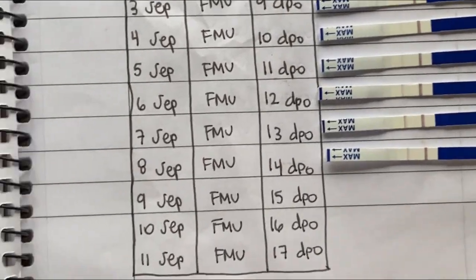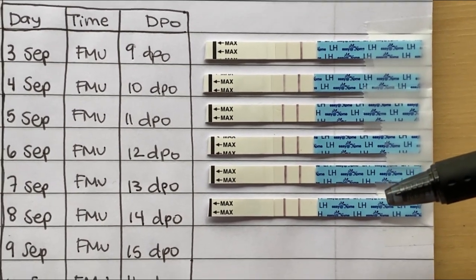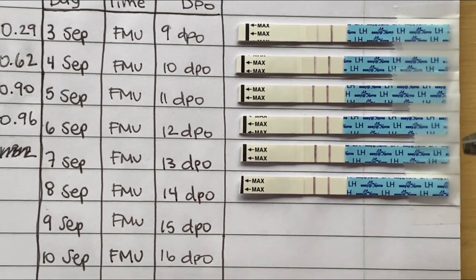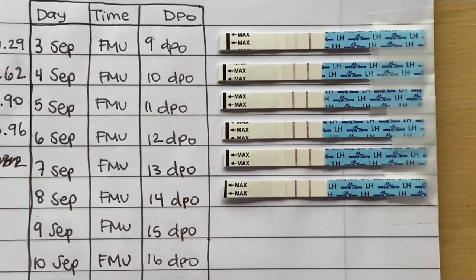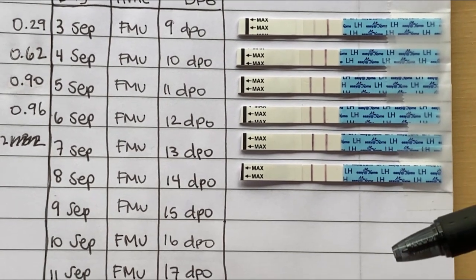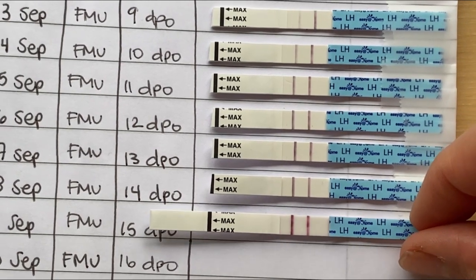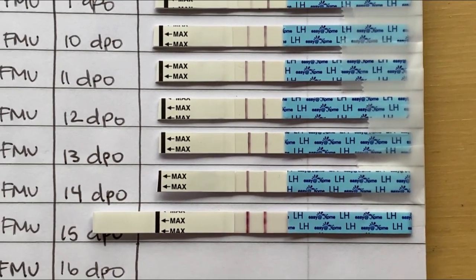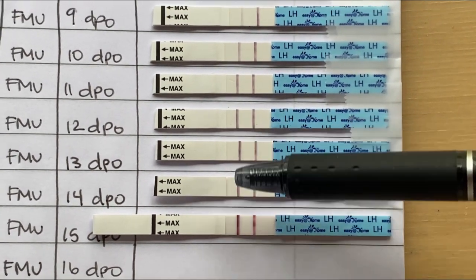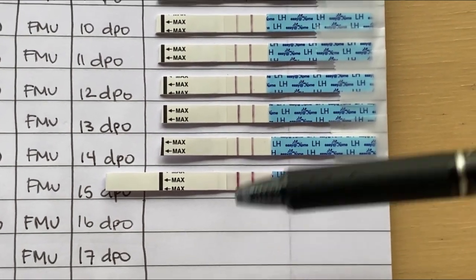And then lastly, my OPK. Now, to be fair, when I looked at my OPK line progressions in my last pregnancy, once it got to be a bit of a dye stealer, it didn't get dramatically darker after that. And I think I stopped even testing OPKs at 15 DPO last time, so I don't even have that much of a history or line comparison to compare it to. But here's the test I took just now. And again, it looks a little bit more of the same. And I just think it's going to take many, many more days for these lines to progress in the same way that a pregnancy test would.